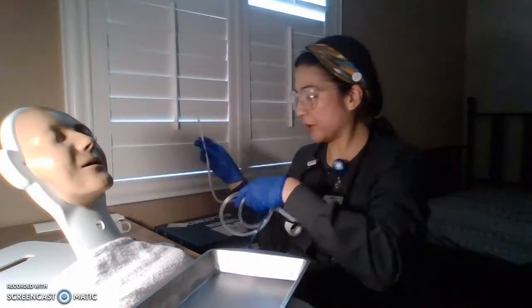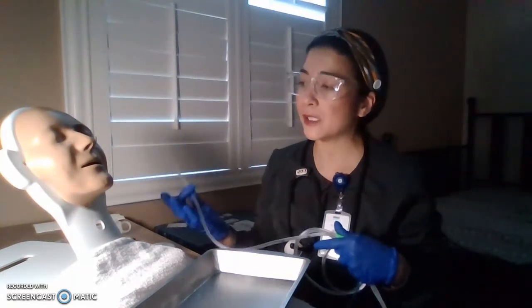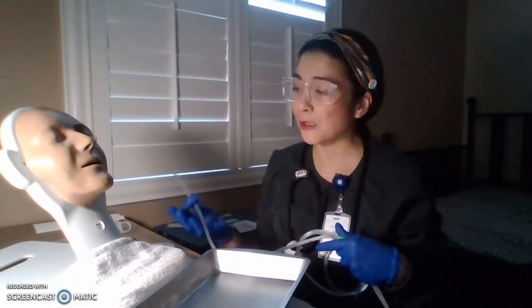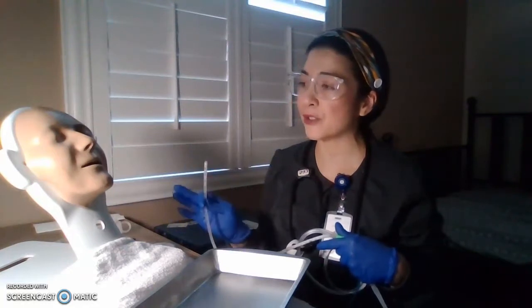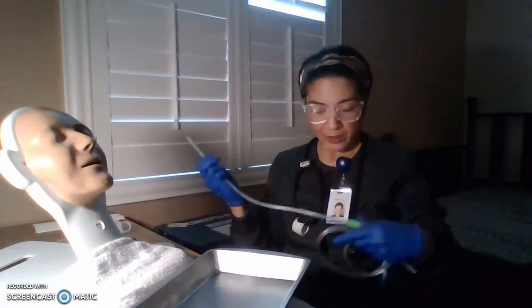So before anything else, make sure again the patient is comfortable, and let them know, Mr. Sunny, if there's anything that you need to tell me or you want me to stop, just raise your hand or your finger and I'll stop the procedure, okay? All right. So now let us begin.